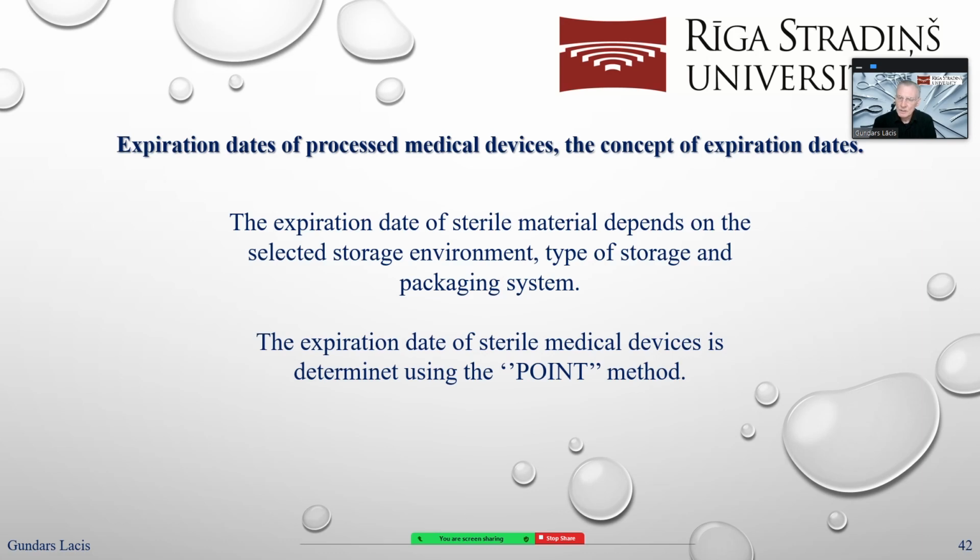And the expiration date of sterile medical devices is determined using the point method. The point method was established by Dutch engineer Jack van Asten. It was done in the 1990s, and he spent 6 years on this. So, checking how long we can store instruments in sterile stocks before they start to be non-sterile.